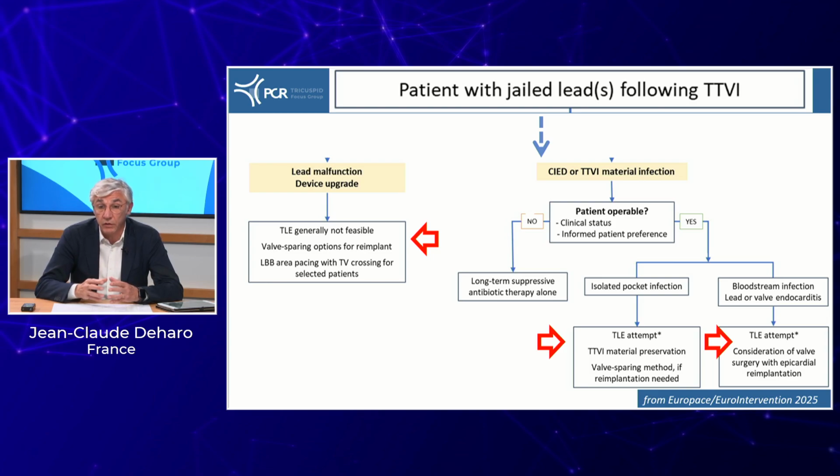And in case we have a tricuspid endocarditis, we will have to remove all the material, including the leads, but also the repair system, which is a really very, very difficult situation. So please think in advance about not jailing a lead, because the situations might be intractable.